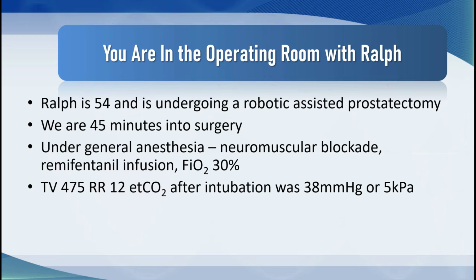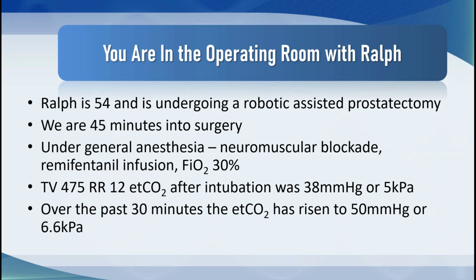Tidal volume is 475, respiratory rate 12, and end tidal CO2 after intubation was 38 millimeters of mercury or 5 kilopascals. Over the past 30 minutes, the end tidal has risen to 50 millimeters of mercury or 6.6 kilopascals. What's going on here?